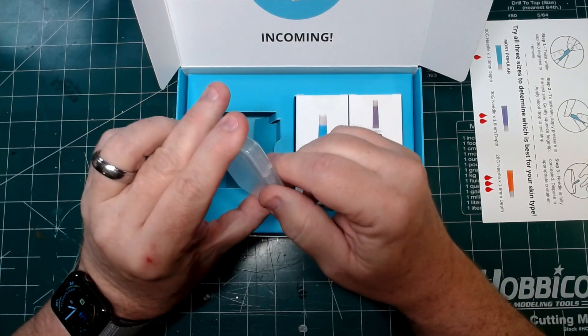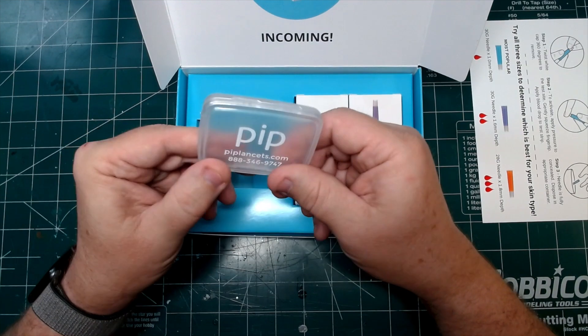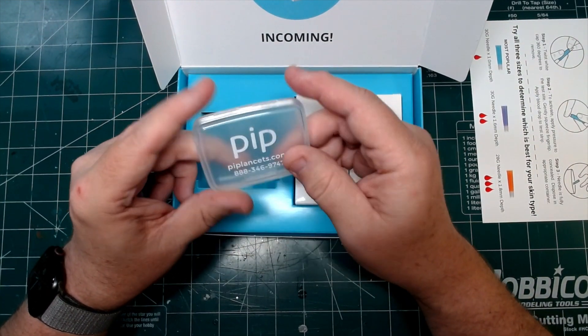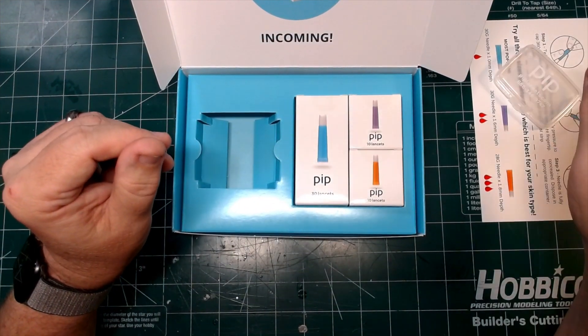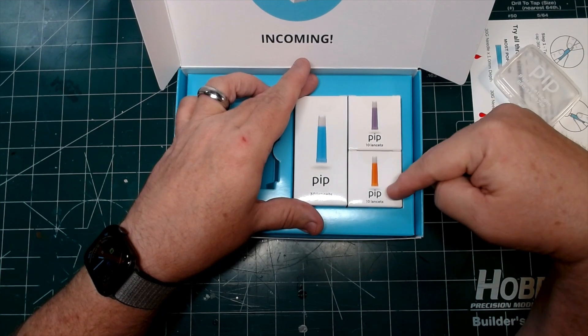Here is the little carry case for them. What I like is that it has their website address and their phone number right on the case to help you in case you need to order. So here are the blues, the purples, and the oranges.